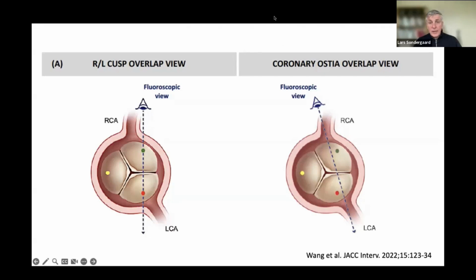So that's just to say that it's a little bit more tricky than just looking at it. But I think most of us as cardiologists didn't. At least I didn't know about this coronary ostial eccentricity a few years back before we started to talk about that. But if you ask a cardiac surgeon, he would tell you he knew exactly that from what he'd been seeing during procedure. We need to be better at learning from our surgical colleagues. I'm sure we did, and we can learn a lot here. Yeah.